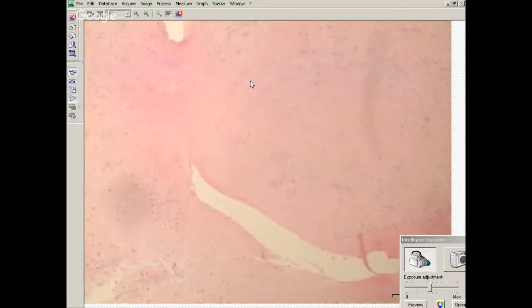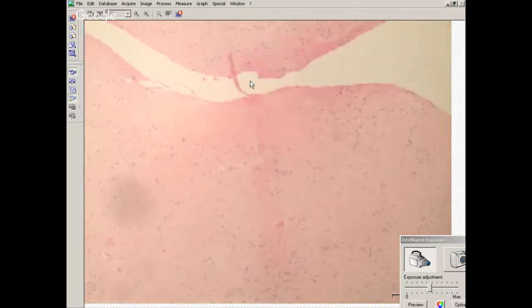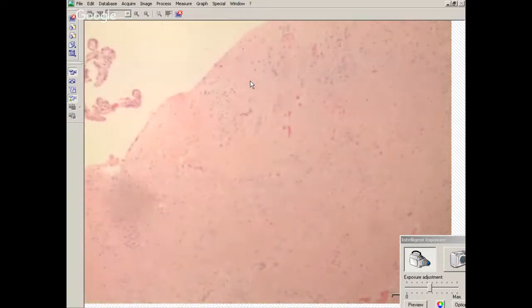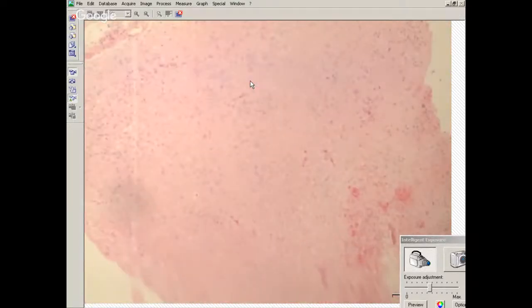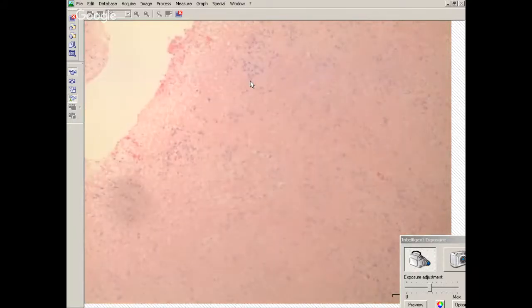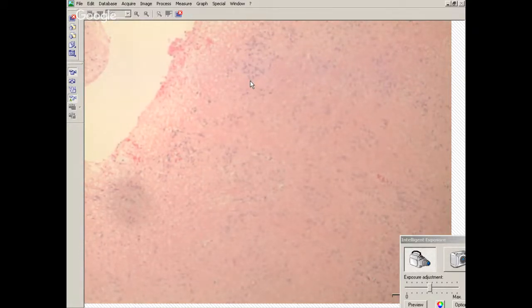That looks all the world like what we just saw. So you get these tumors and the surgeon sends it to you, and this is the pattern. You stain it with GFAP, it's going to be positive. You stain it with a proliferation marker, MIB1, it's going to be very, very low. This is a subependymoma. Subependymomas are tumors that are slow growing, attached to the subependymal region of the ventricles.